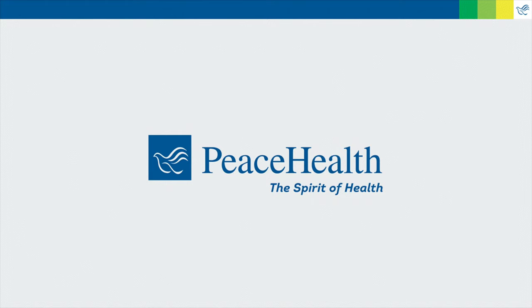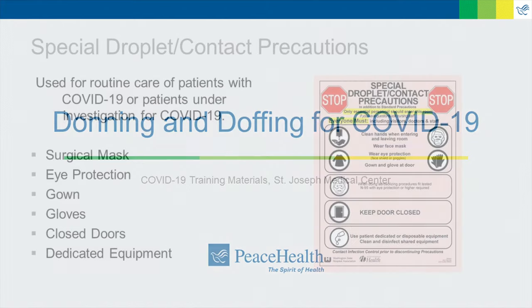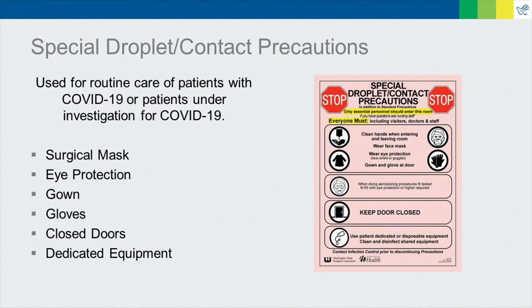In this video, we're going to demonstrate the proper donning and doffing of personal protective equipment for special droplet contact precautions. For all patients who are positive or under investigation for COVID-19, caregivers will need to implement special droplet contact precautions.